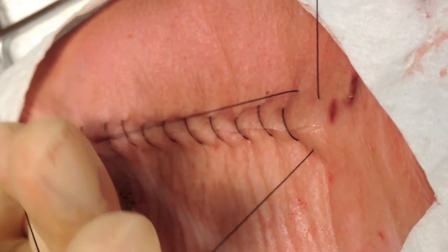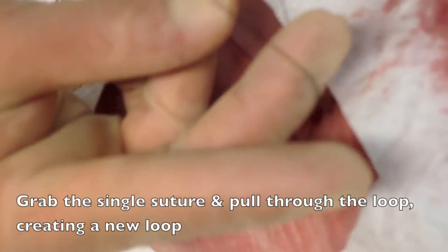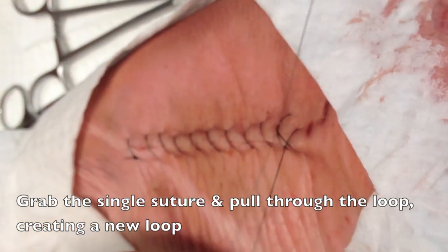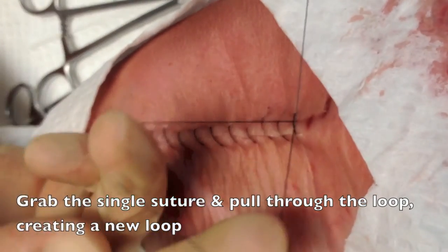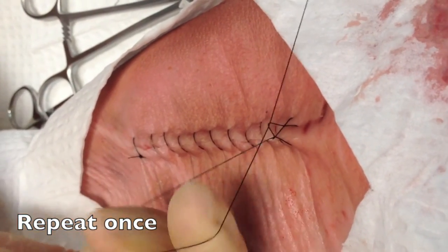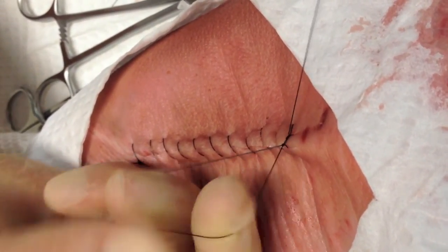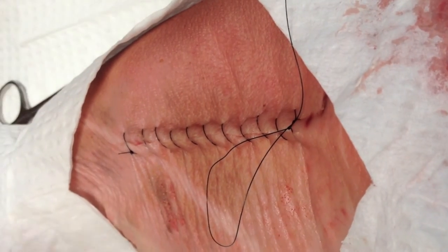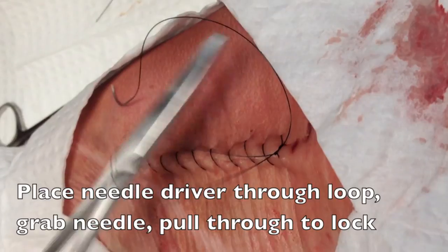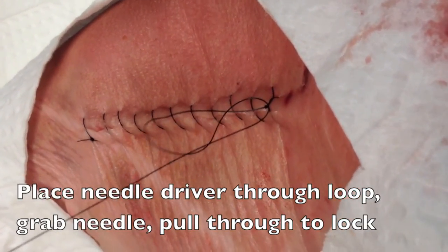With your free dominant hand, grab that single suture material edge and pull it through the loop, which will create a brand new loop. You're going to repeat that process again. Make sure to keep the needle at a distance from your fingers to prevent a stick. Finally, grab an instrument like your needle driver, send it through the loop, and grab that needle end and pull it through the loop in order to lock the suture.